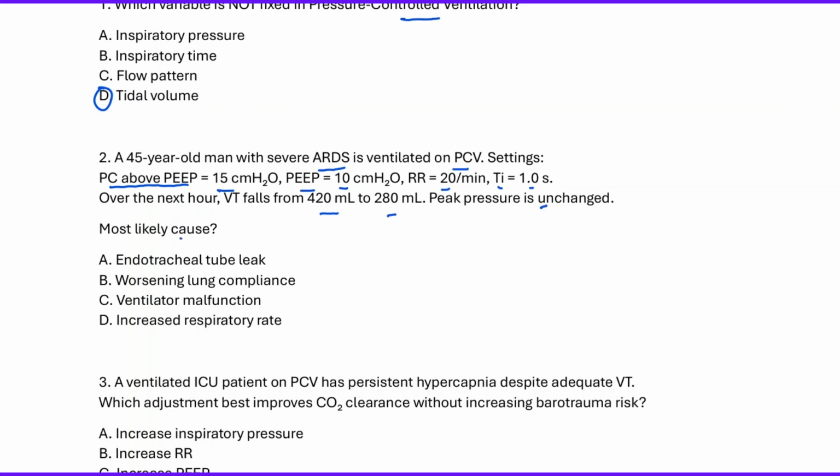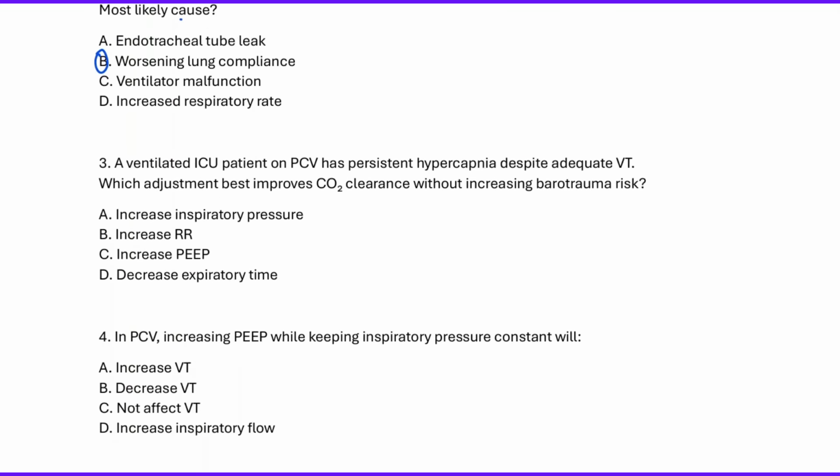So most likely this patient is having what? Likely having worsening lung compliance. So there's worsening lung compliance, which explains why the tidal volume is falling and the peak airway pressure is unchanged. So the best answer there will be B. Moving on to the next question.